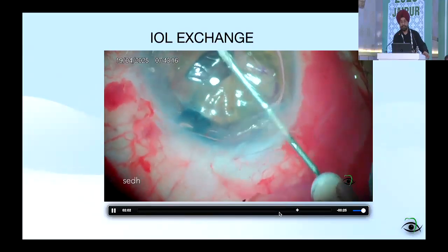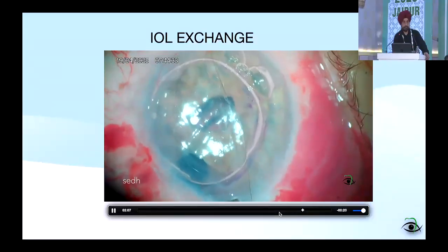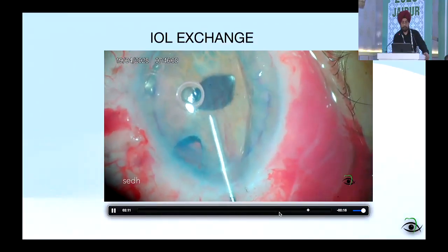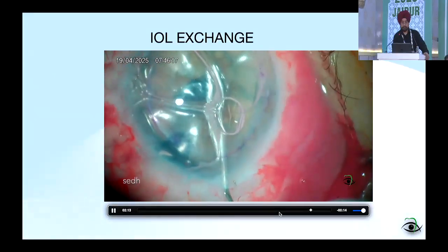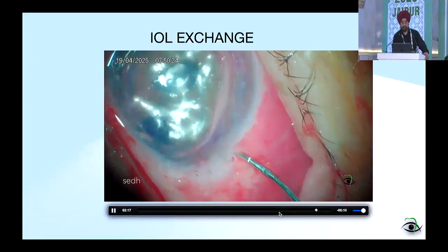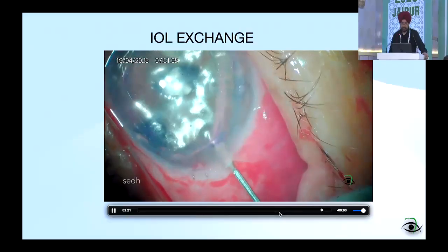So I prefer a needle insertion, hence it's done, then you wash, and first you secure the suture wound so that there's no dislodgement or expulsion of the graft when you irrigate, and then the bubble underneath is going to settle it.